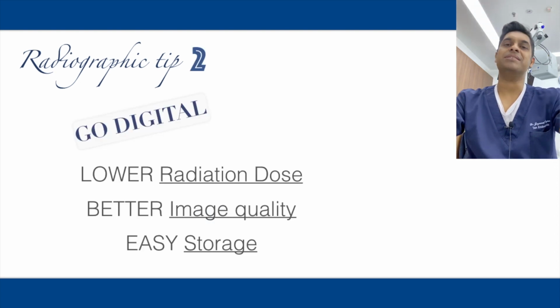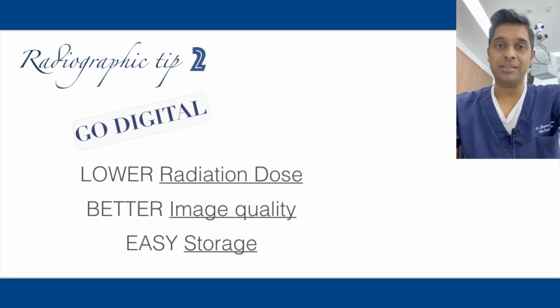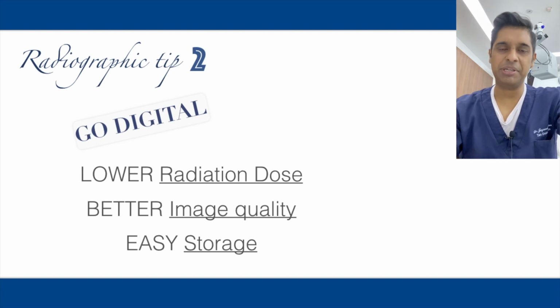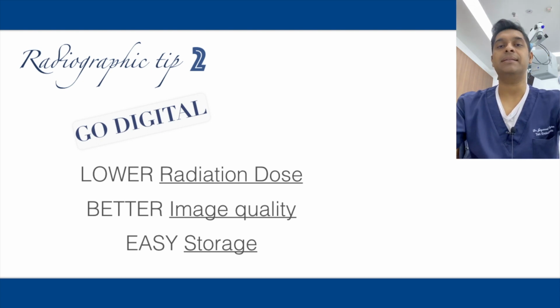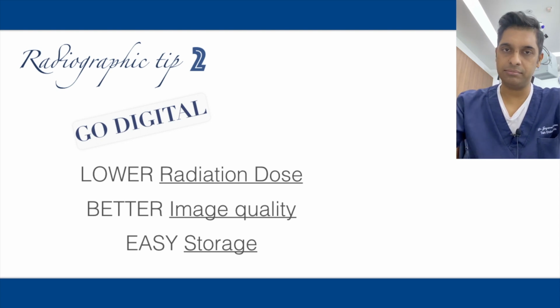Tip 2 is to go digital. There are numerous reasons to go digital. These are the 3 popular reasons. One is because we want to lower the radiation doses for our patients. Second, we want clearer images, because we want better image quality in order to interpret radiographs. And third is for the storage. It's easier to store digital x-rays than your regular films in your clinic.